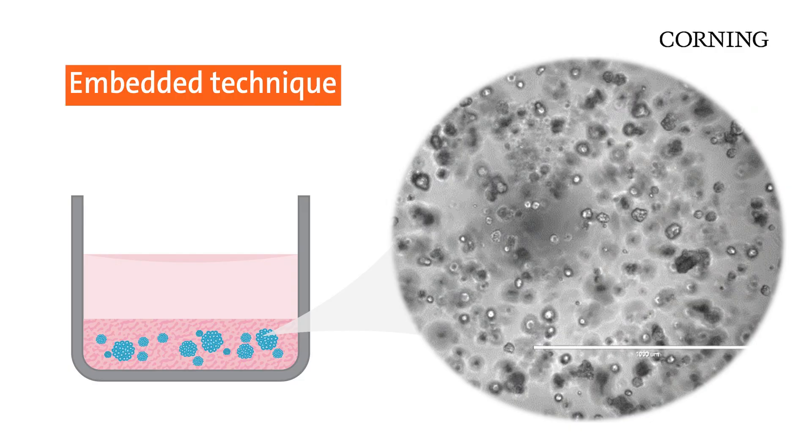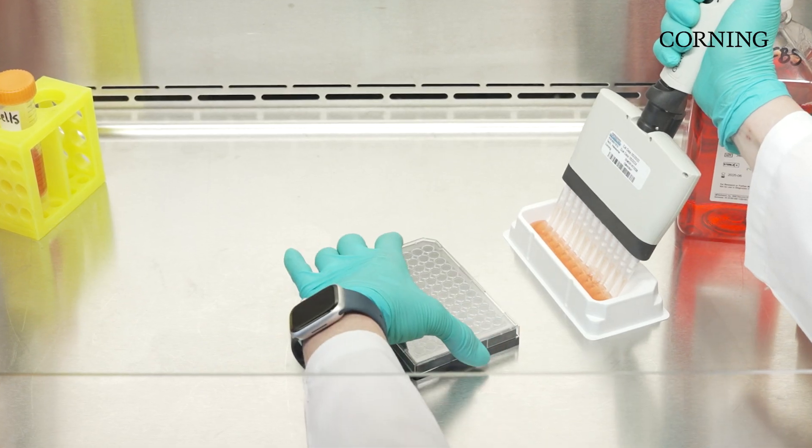Looking at the photomicrograph, you can see that the 3D structures are dispersed all throughout the Matrigel, which could make imaging challenging.